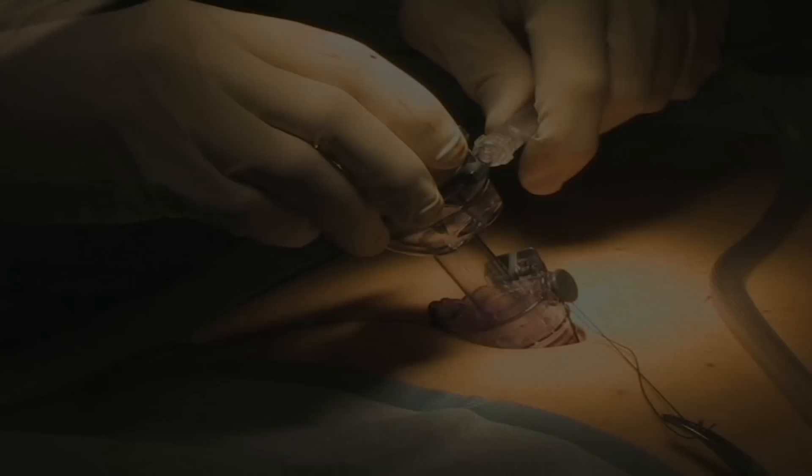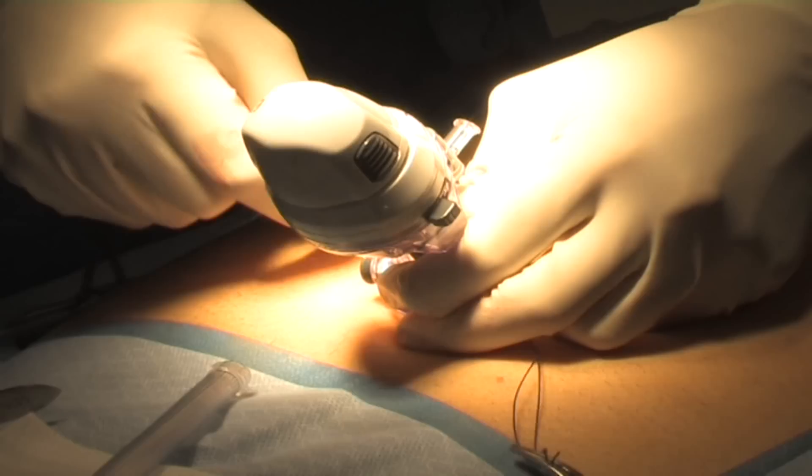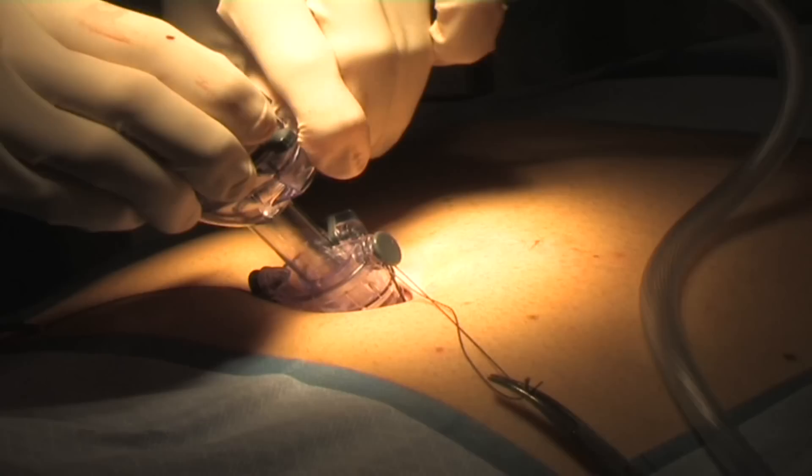A 10 mm incision is made just below the umbilicus or belly button and a port is inserted through this incision into the abdominal cavity. A gas supply is then connected and the abdominal cavity inflated with carbon dioxide to a pressure of approximately 15 mm of mercury.